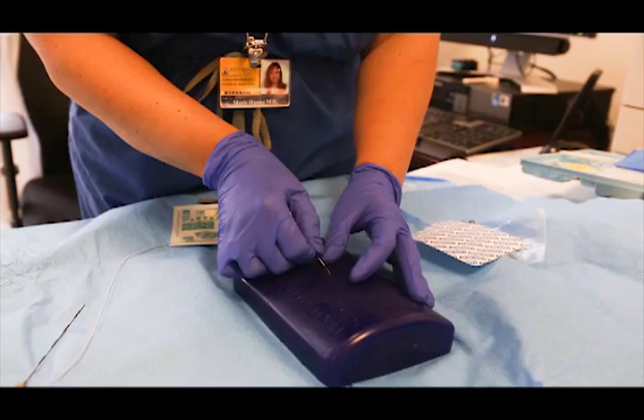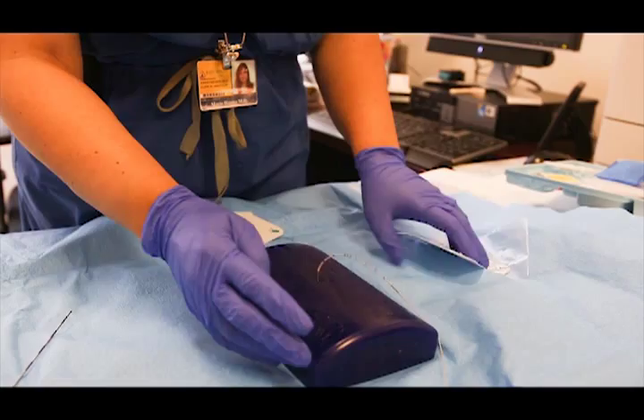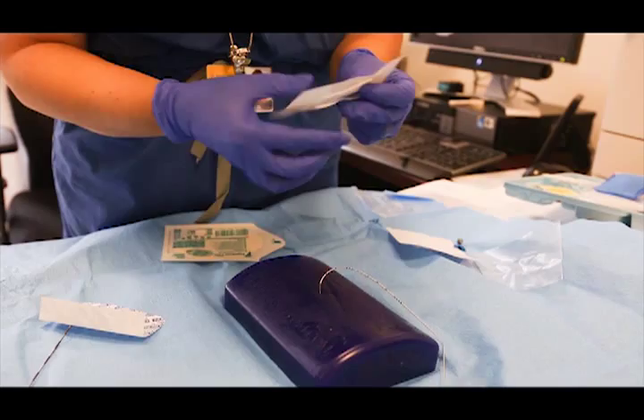This is the epidural in the patient's back. I want to tape it at 12. So after you thread the catheter, you try to make a loop. Now the wrong part when you put a SORB-A-View — I'm going to show you in a minute — is that the SORB-A-View in the middle is not sticky.